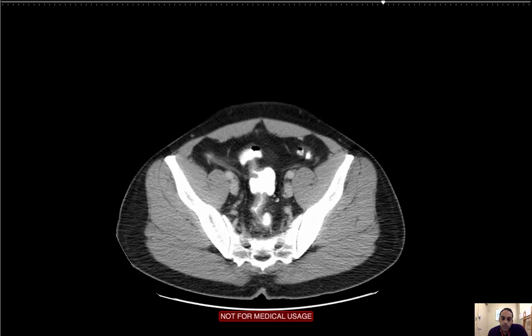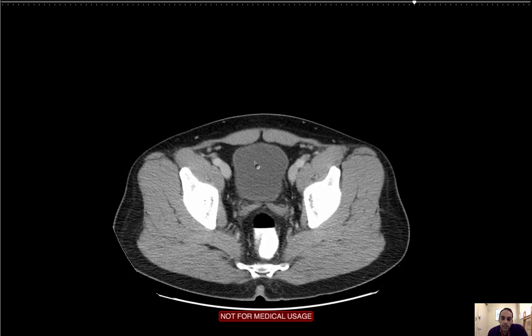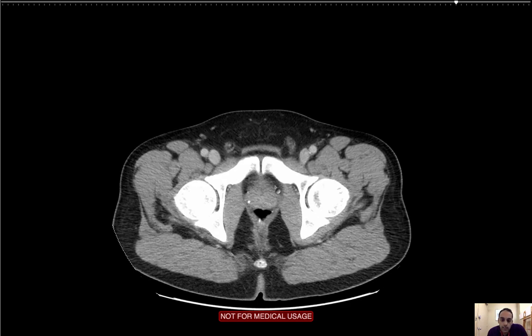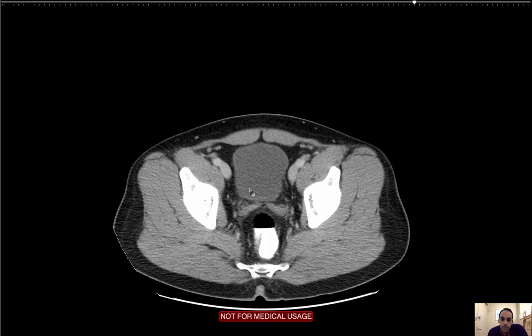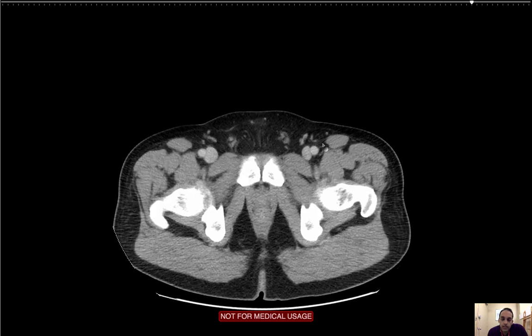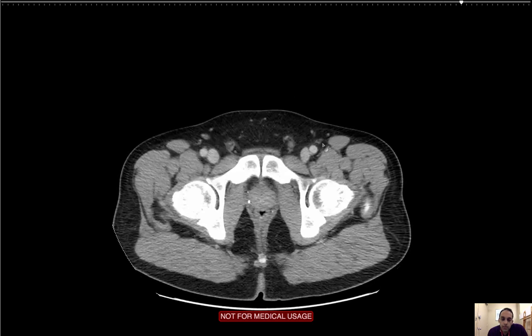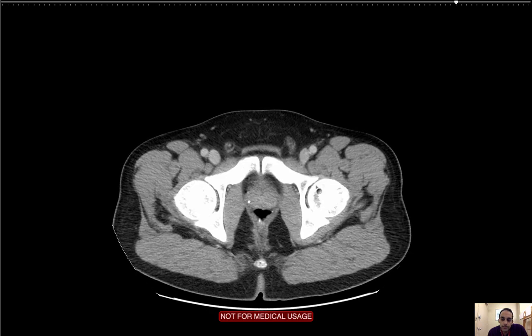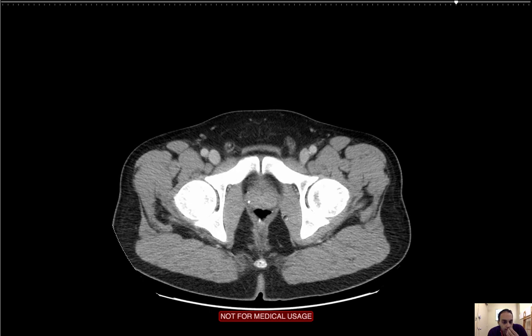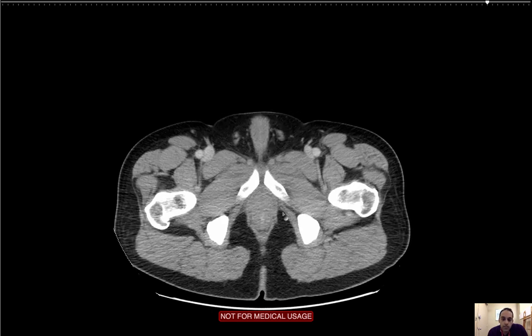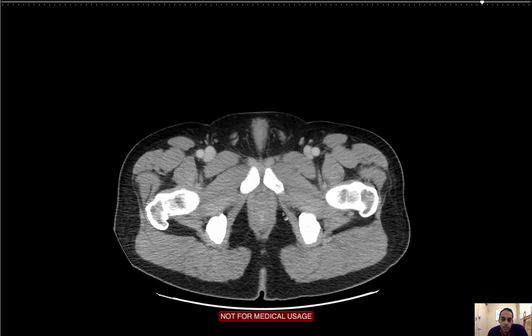Now I'm here down at the level of the bladder. Quickly looking at the bladder — it should just be full of urine, no lesions or thickening on the bladder wall. The bladder is unremarkable. Continuing down, I can see the prostate, which is normal in size. Coming up a little bit, I can see the seminal vesicles, which are symmetric in size bilaterally with no focal lesions. The seminal vesicles are unremarkable.